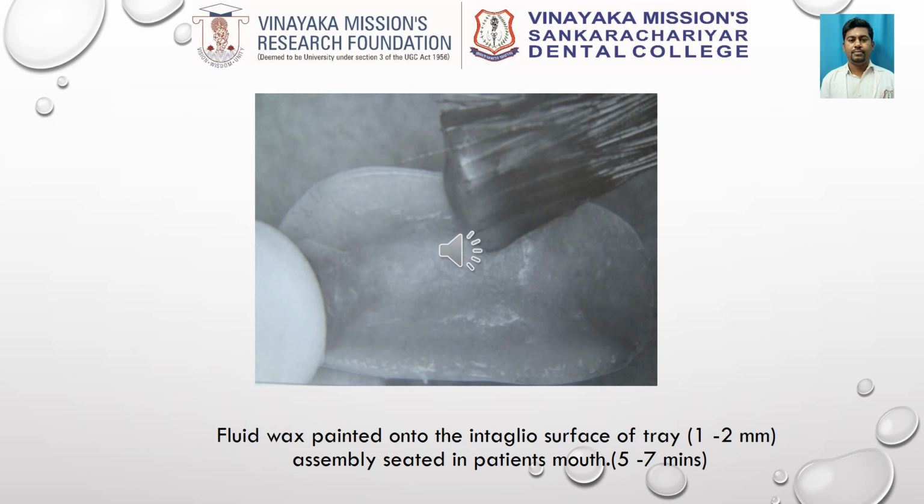The now molten fluid wax is painted onto the intaglio surface of the tray, where we already have a space of 1 to 2 millimeters, which is created by the spacer, and this properly assembled tray is seated in the patient's mouth for a minimum of 5 to 7 minutes. And bear in mind, this is an open mouth impression technique, or an open mouth border molding technique, where you don't ask the patient to bite or displace the fluid wax in function.